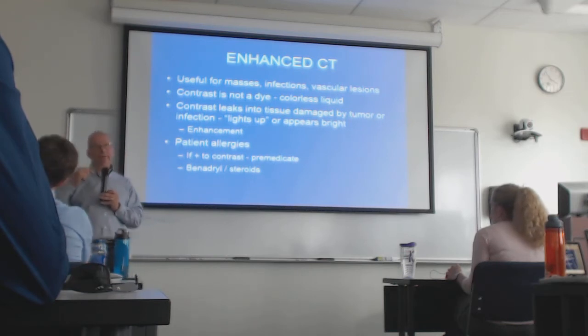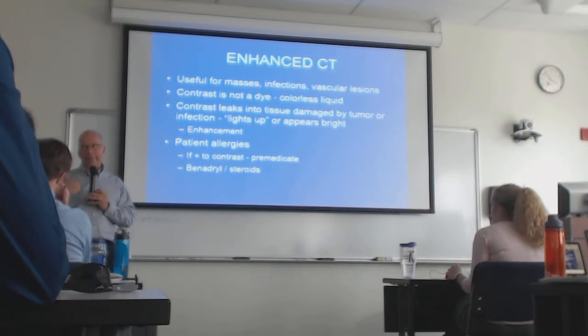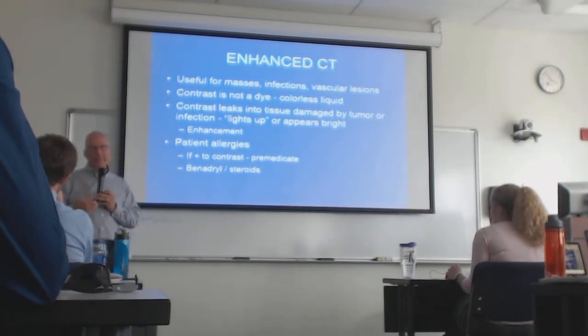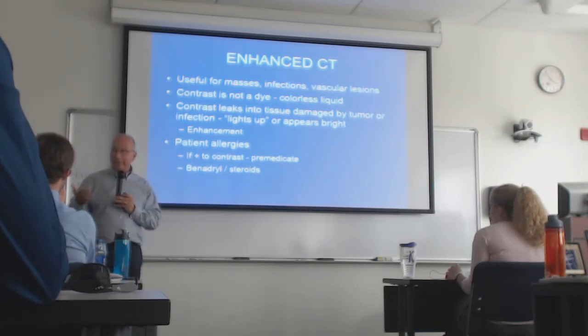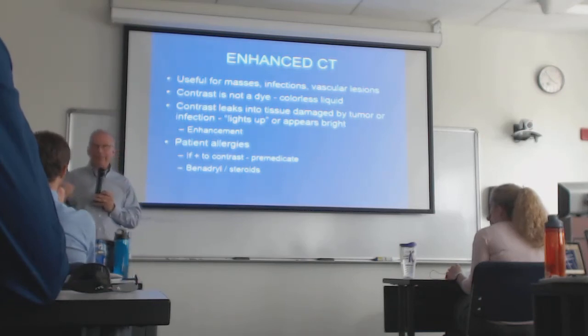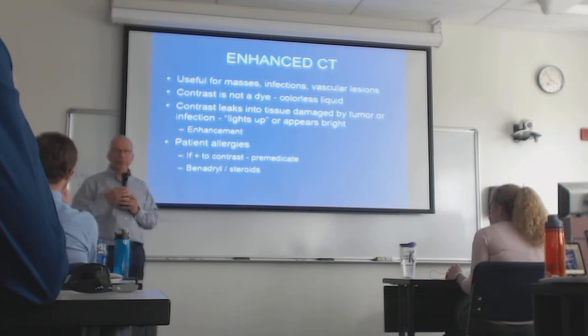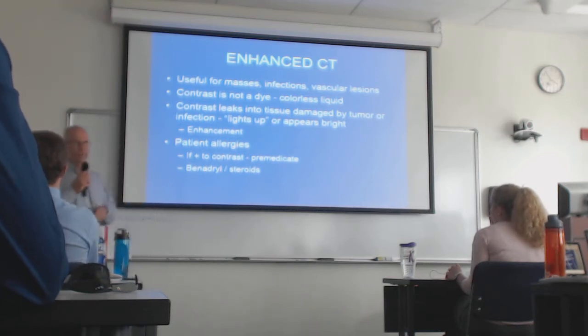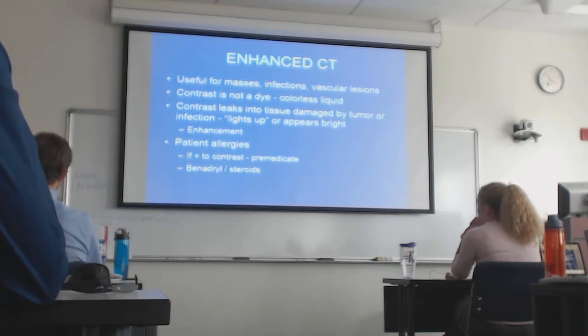It's the same reason why someone drinks barium to have an upper GI. The barium atoms in the barium are very radiodense, and when I use fluoroscopy, I see white where the barium is. If you just drank water, I wouldn't see anything, because your whole body is essentially made of water. So it's no different. We use this IV contrast to light up blood vessels and to light up tissues. Some tissues are more vascular than others, and we'll see them better.